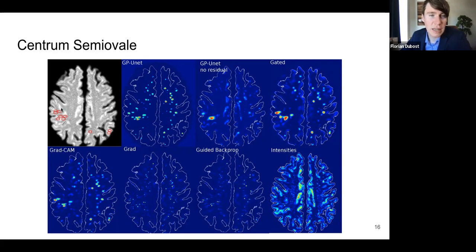Okay, so you see, the ones I circled actually correspond to dot annotations from the radiologist to indicate perivascular spaces. And you notice that a lot of methods detect perivascular spaces in this upper region here. But that's not been indicated by the rater. And those little hyperintense structures, yeah, they actually are perivascular spaces, but they were just not annotated by the rater for whatever reason. Maybe they just missed them, maybe they thought their intensity is too low. That's what I was explaining earlier about the enlargement of perivascular spaces being a continuum.